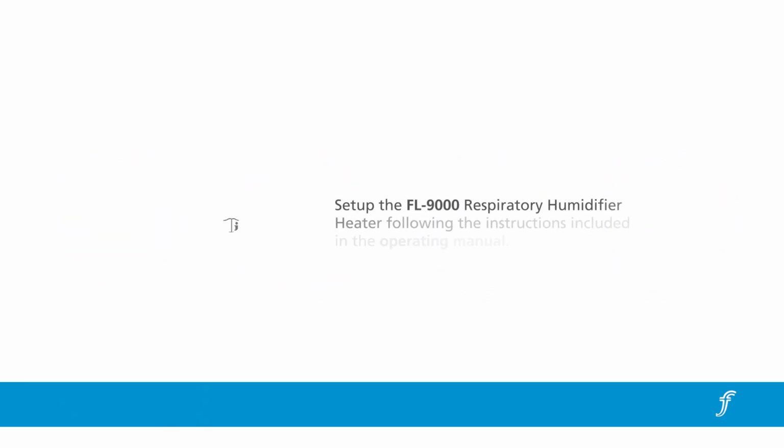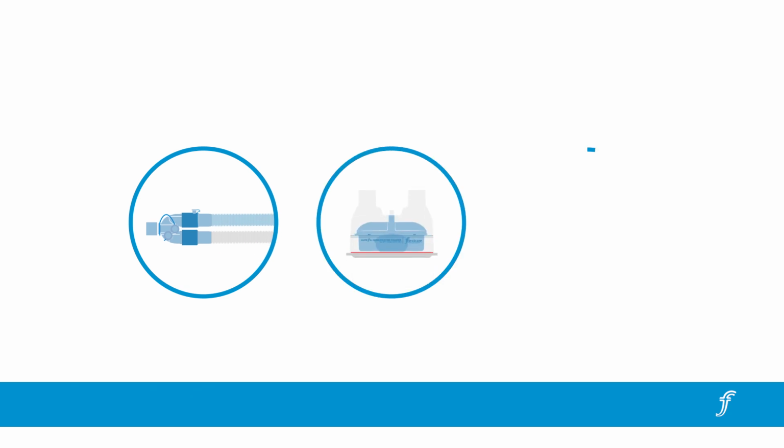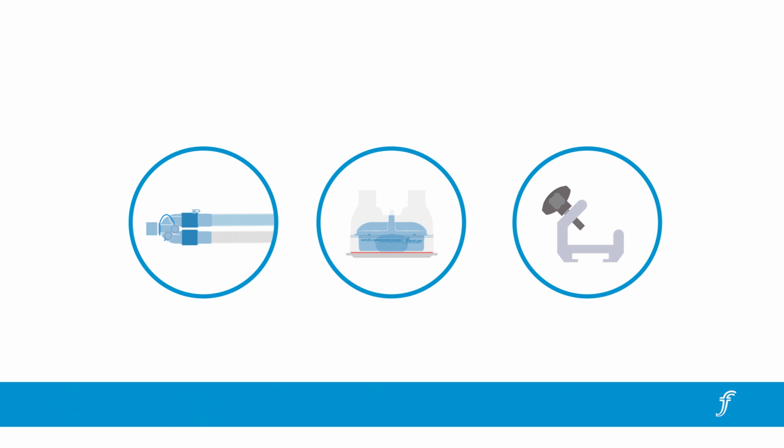Set up the FL9000 respiratory humidifier heater following the instructions included in the operating manual. The use of breathing circuits, humidification chambers, and other accessories which are not approved by Flexicare may result in suboptimal performance and may place the patient at risk.